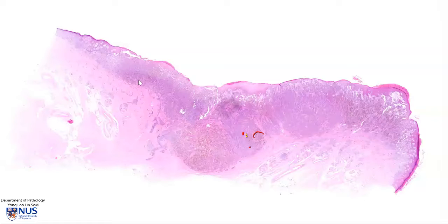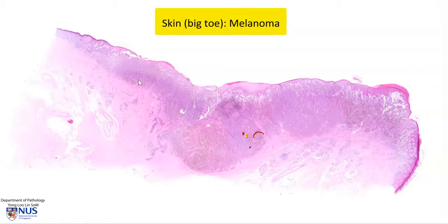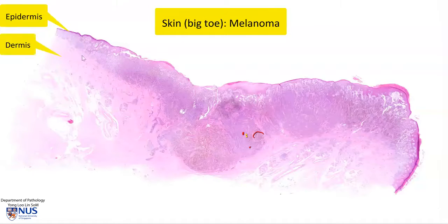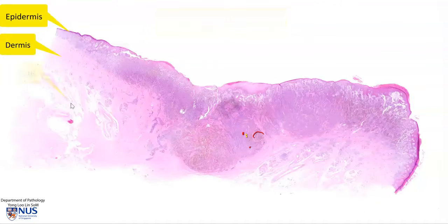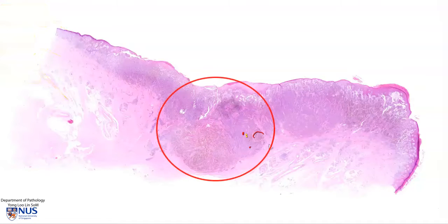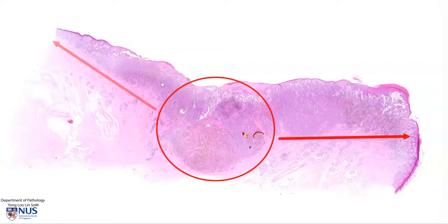This is a virtual microscopy slide showing a melanoma of the big toe. We are looking at the skin, where we can see the epidermis, the dermis, and the subcutis. The main bulk of the tumor is in the central area, but it is also extending to the right side and to the left side.